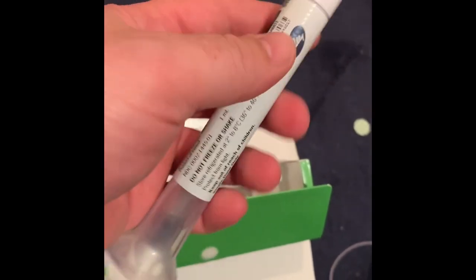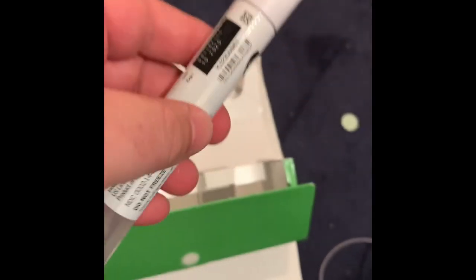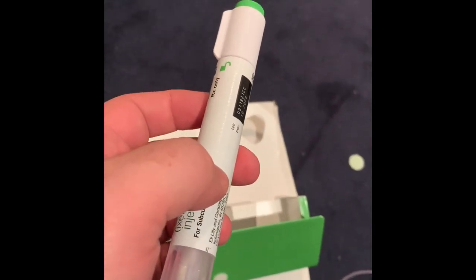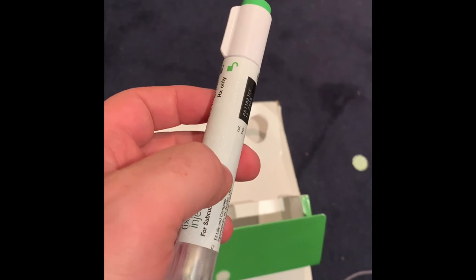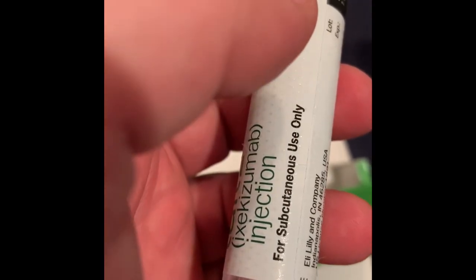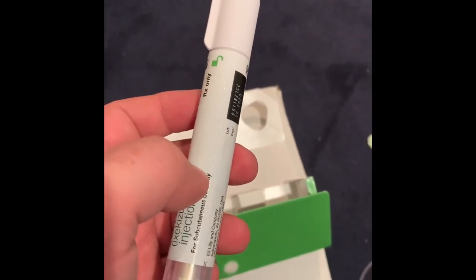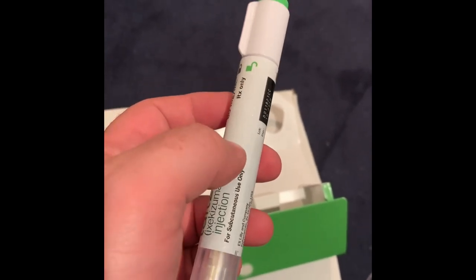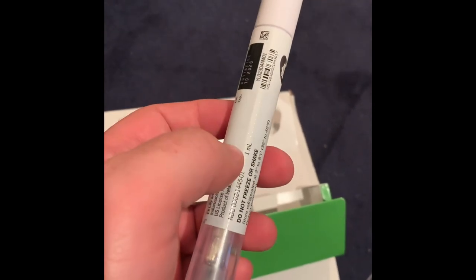There's the Eli Lilly logo. I'm a pretty big guy, so I get the 80 milligram one. I should mention that in the beginning, my first dosage was actually two of these. I did get a little bit of an allergic reaction — not too much — just a tiny bit. It was burning probably for like two or three days with a slight rash, but that was only on the first two injections. The next injection was a single injection.